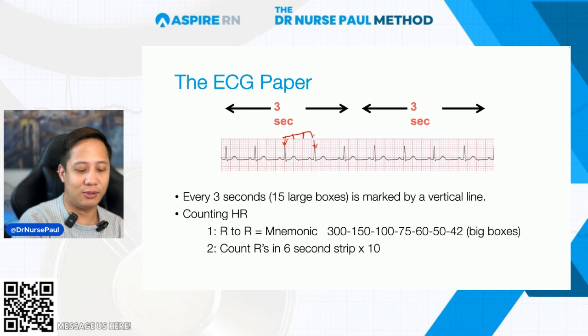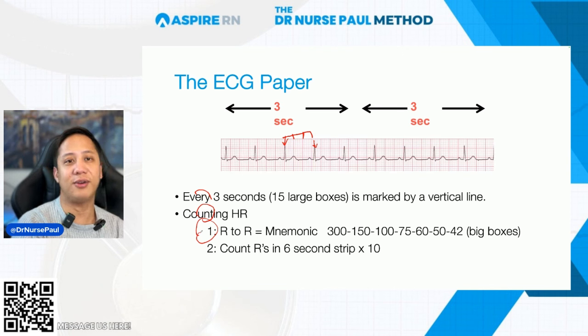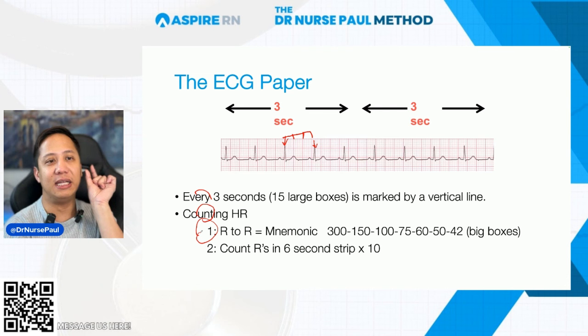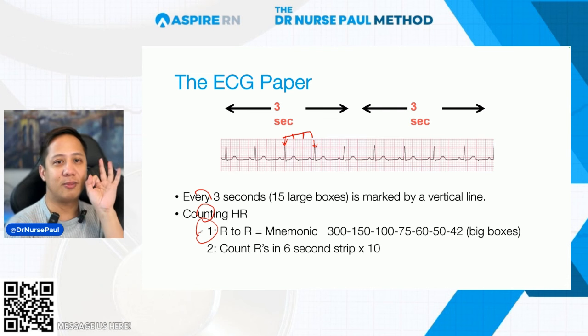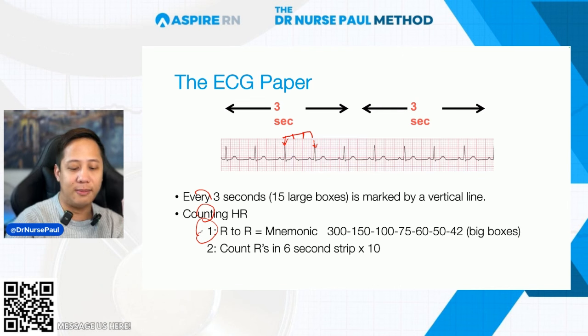I'm going to teach you guys how to count R2R. I'm sorry. Oh, my God. All right. I'm sorry. This is terrible. There we go. Count R2R. Three large boxes. Agree? Three large boxes and one very tiny box, right? So very tiny box or small box. Three large boxes. So using that information, we're going to memorize the constants.